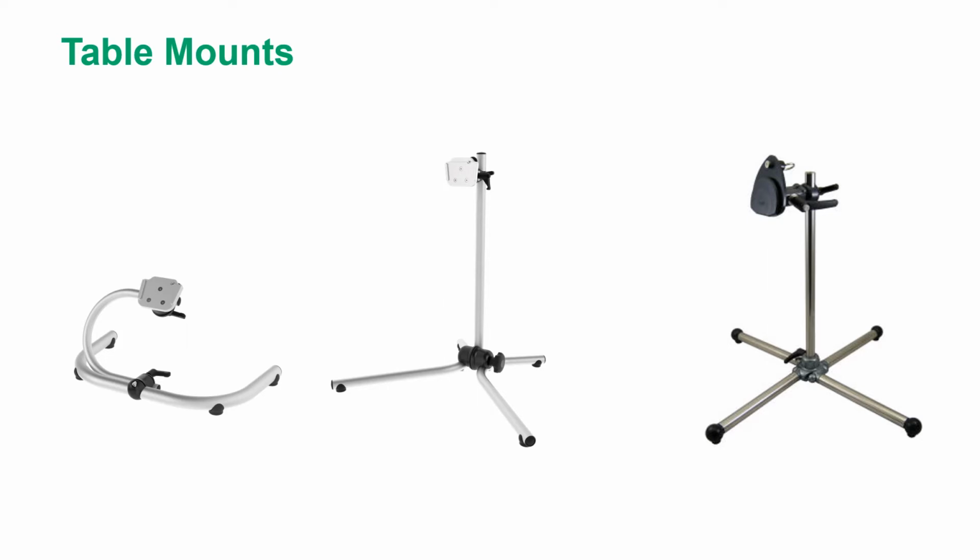Let's start with table mounts. A table mount is typically stationary and rests on a desk or surface. There are different types of table mounts. Some work only on flat surfaces, while others work on uneven surfaces. They are used by people needing extra support for their AAC device while sitting at a desk or table.